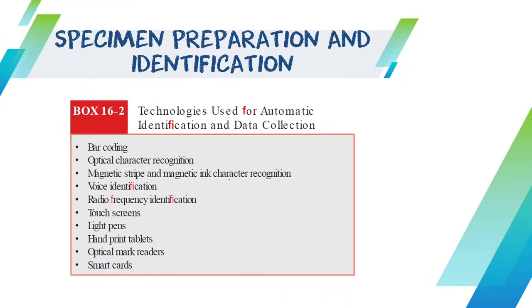So, let's proceed with our first step, which is your specimen preparation and identification. Now, as you can see here in this table, these are different technologies used for automatic identification and data collection of your specimen. And actually, some laboratories are already using this, especially when we talk about barcoding. During my internship, one of the laboratories I learned was using barcoding was SPMC.